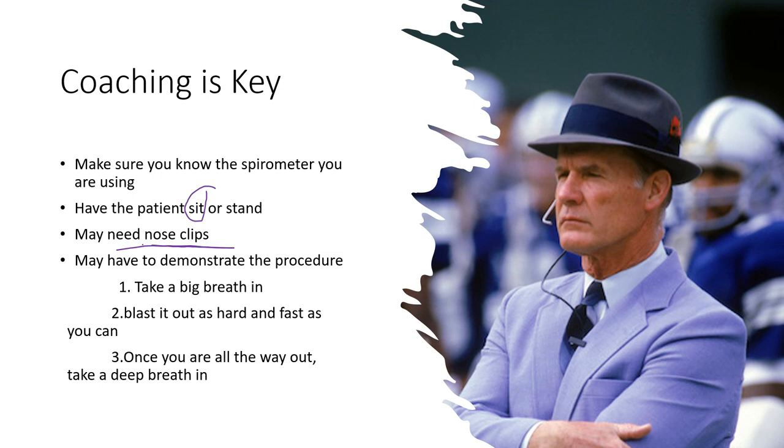You might have to demonstrate this for the patient. Usually things go a lot faster when you do, in my personal experience. So I'm going to have you take a deep breath in as deep as you can, and then blow all the way out really hard, as hard as you can. Once you're all the way out, take a deep breath in. I always show them that ahead of time so they can see what it should look like versus just hearing it. Not many people can just hear something and do it right away, so showing them can be a very helpful tactic.